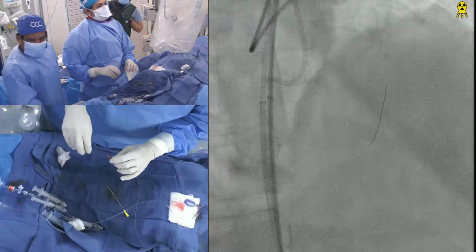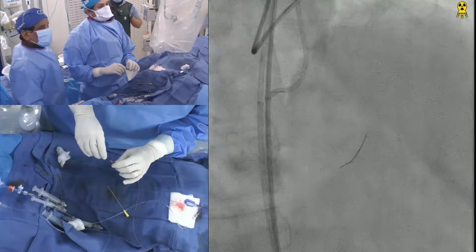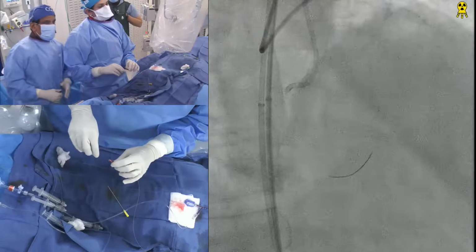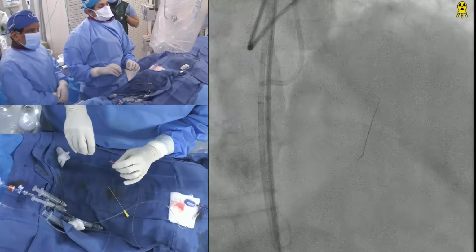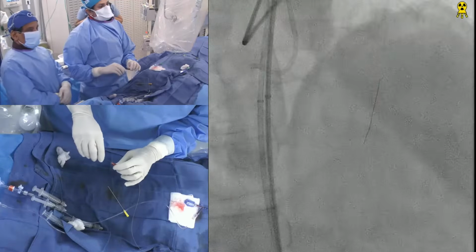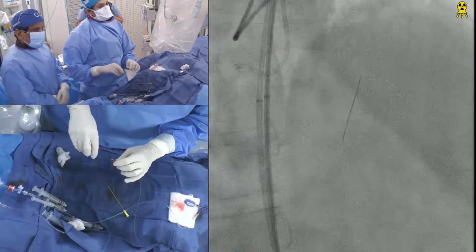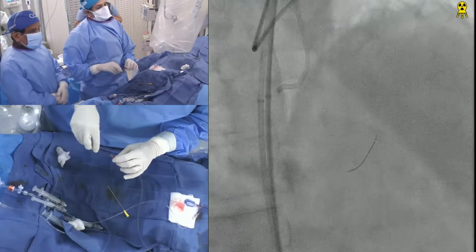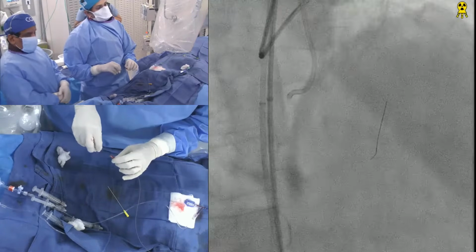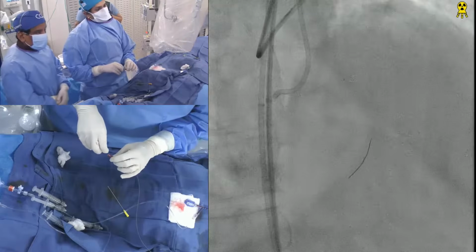Septal surfing. Surfing the septal, that is another suggestion. Wonderful feedback. You want to try that? Surf the septal. Surfing is okay.